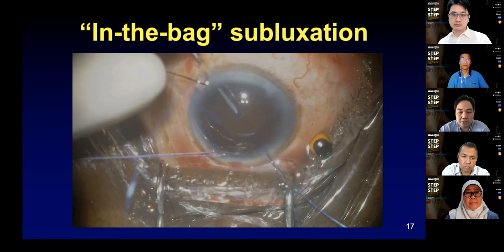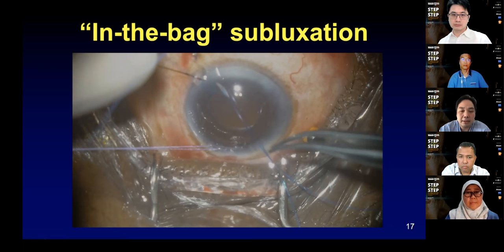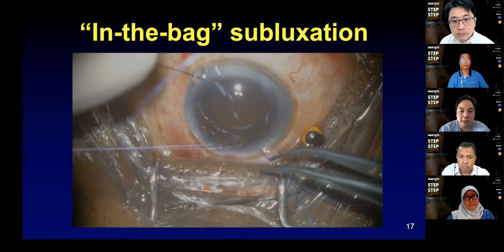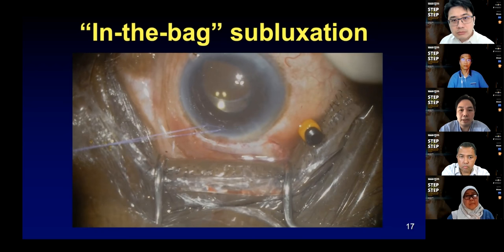When you have the bag present, you're not going to have that lasso sliding along the length of the haptic, and you can fixate it quite securely this way. It's a double-ended Prolene, and you pull through. As you see afterwards, you cut a loop coming through, and you yank it a little bit harder, and you see that it catches the lens.